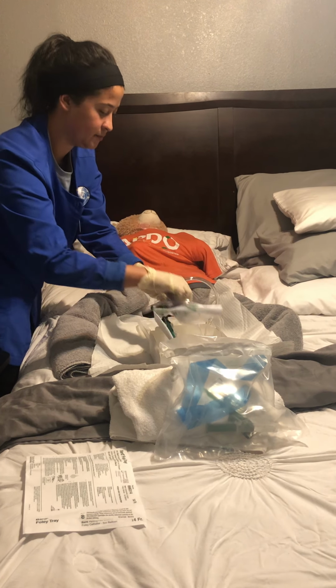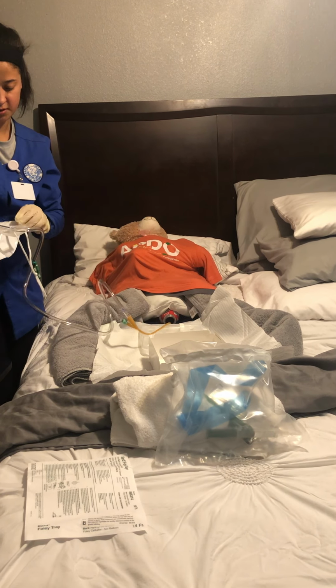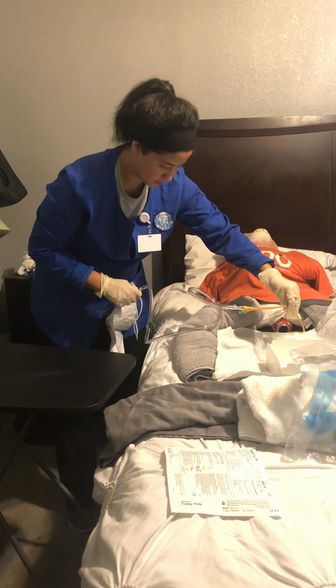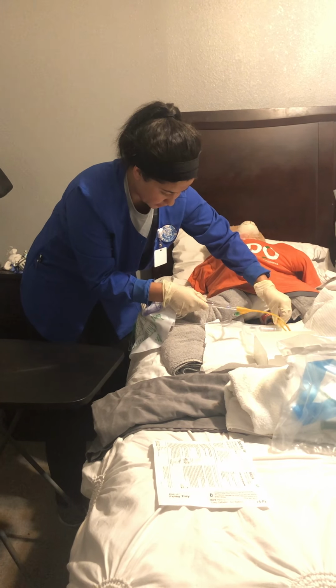get my patient's bag, go over the leg because I don't want to go under, place it. I don't have a clip, but I would, nope, it didn't stay, but that would not happen because it would be inflated and it would stay.